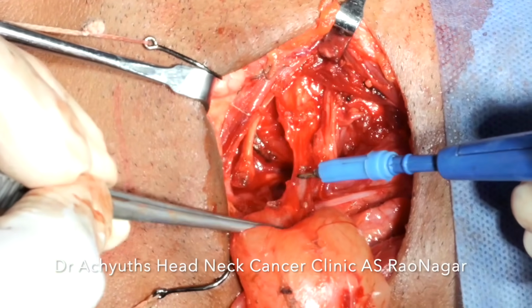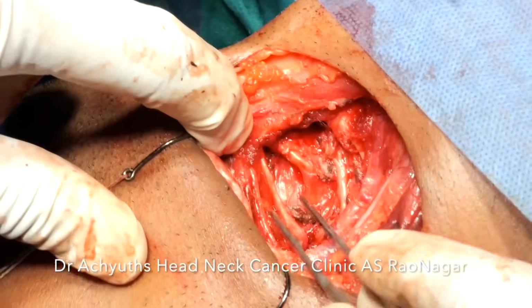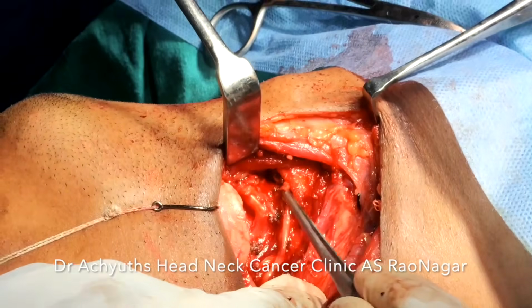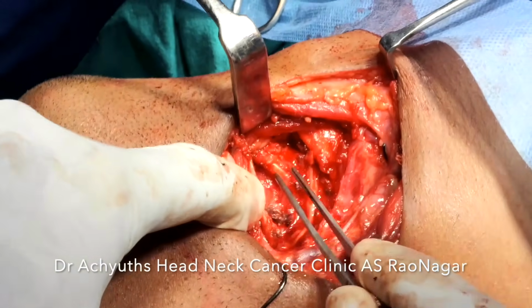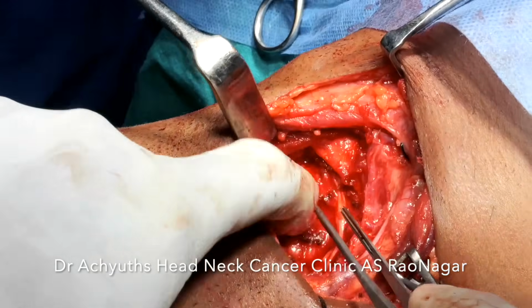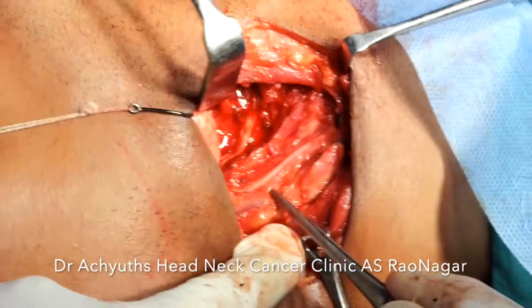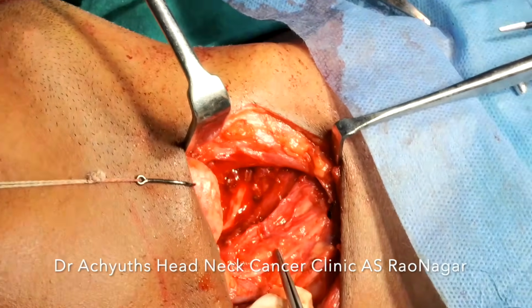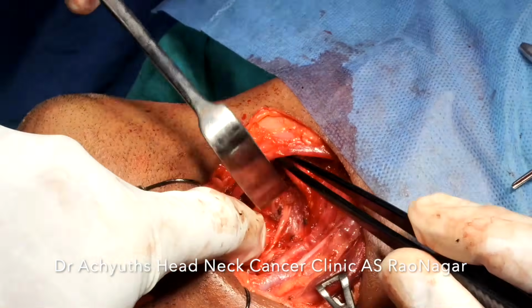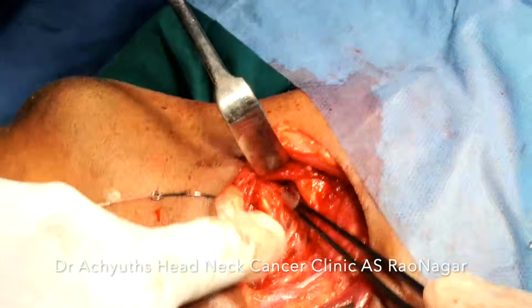So these muscles were used to reconstruct, and the pharyngeal constrictors which were cut from the lateral wall of the, this is hyoid bone, this is the thyroid cartilage, this is internal laryngeal nerve, and that structure is the epiglottis. The mucosa is intact, and we confirmed the intactness of mucosa by doing a Valsalva with water leak test. So we put some saline, we try to give Valsalva, and we see for any water bubbles, because that has to be repaired on the table. We cannot extubate, wait for it to granulate or repair by itself. We have to repair it beforehand.